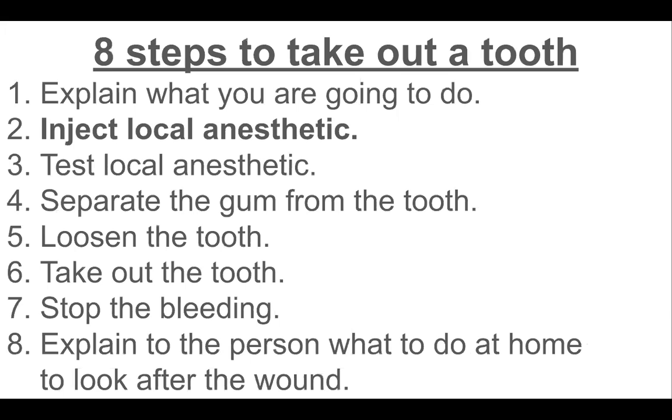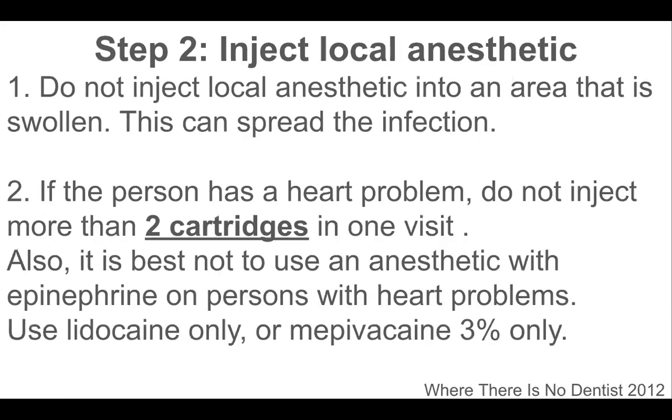After that, you can inject the local anesthetic. Do not inject local anesthetic into an area that's swollen. This can spread the infection. If the person has a heart problem, do not inject more than 2 cartridges in one visit. Also, it's best not to use anesthetic with epinephrine on patients with heart problems. Use lidocaine only or maybe mepivacaine only.